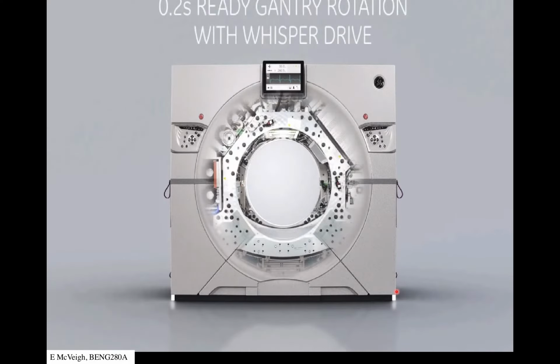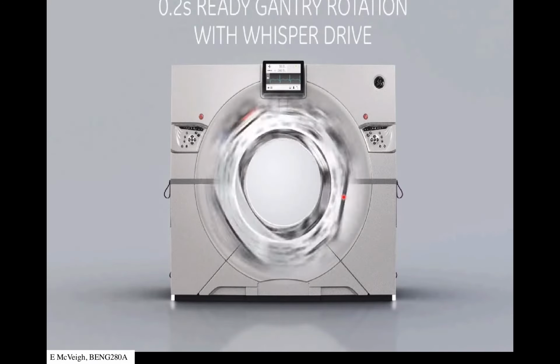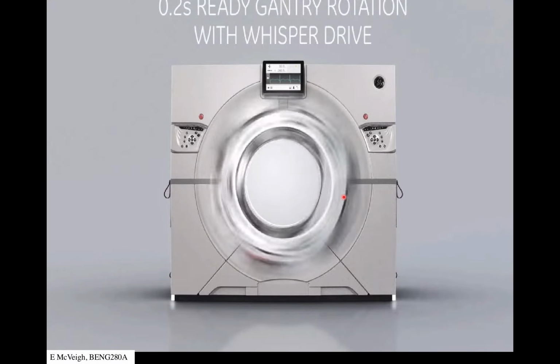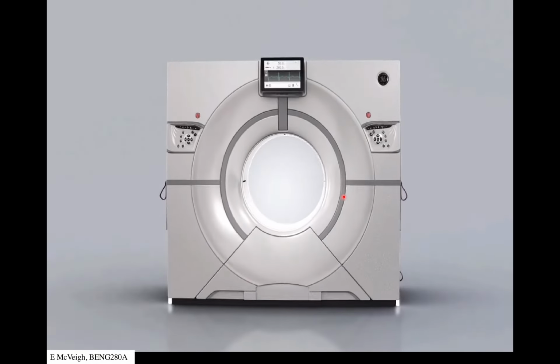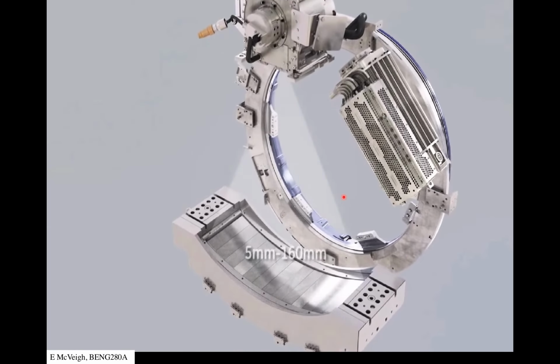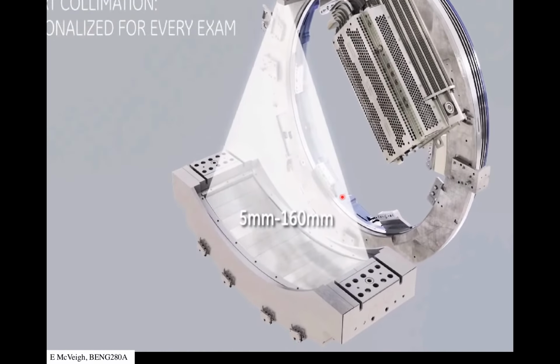So here's the movie. I think I showed this at the introduction, but it's a nice graphic of how the detector and source rotate. It makes a bit of a noise, and now that the rotations are at a high frequency, the noise is sometimes a little alarming, so they've been trying to make these things rotate very quietly.